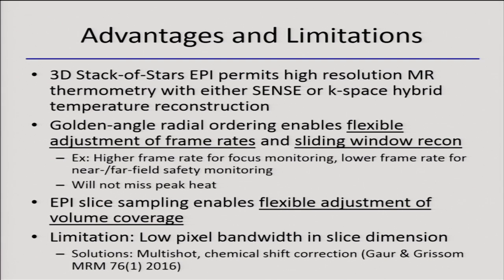Also, the EPI slice sampling enables a flexible adjustment of volume coverage. So again, we can acquire more slices where we care more about monitoring the focus. And I addressed this a bit before, the low pixel bandwidth in the slice dimension. One way we can mitigate that is by going to higher multi-shot factors. And our group has also published another technique for performing a chemical shift correction to compensate for that.